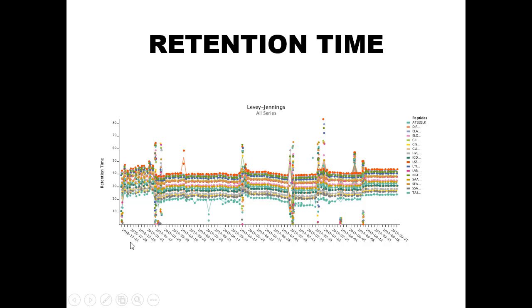So looking at my own data, this is my lifetime data at the time, going from December of 2016 through September of 2017, almost a year's worth of quality control data. My eye is drawn to the left at how variable this data was in December.